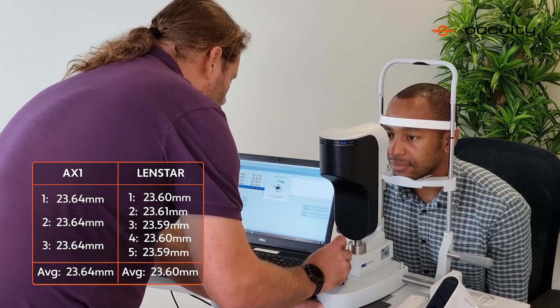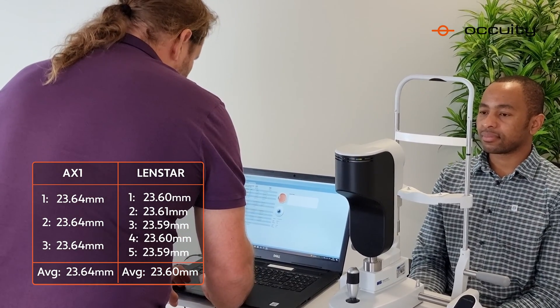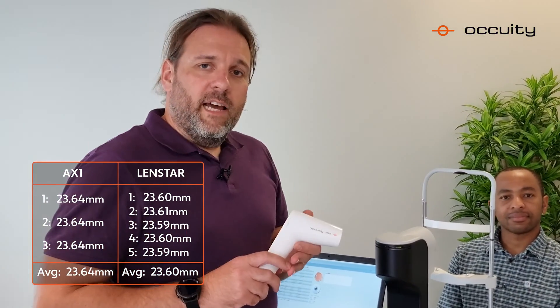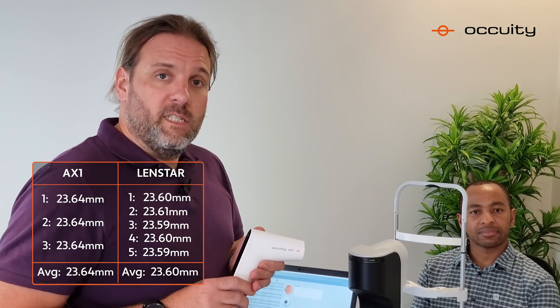Excellent, 23.59mm. Okay, sit back and relax. So you can see the AX1 gave a very repeatable measurement of 23.64mm, and the Haag-Streit Lensstar gave a measurement of 23.6mm. So you can see that they're both directly comparable, and the AX1 offers ease of use and portability in a handheld format.